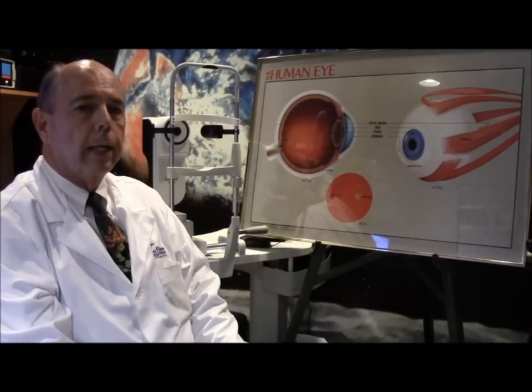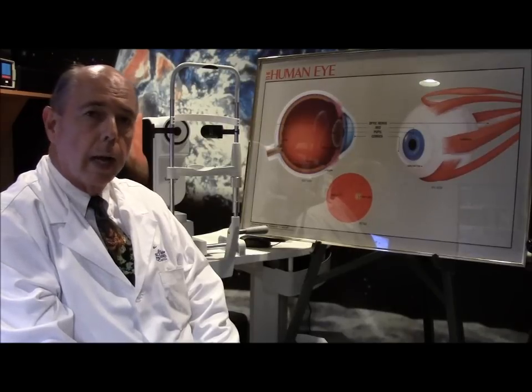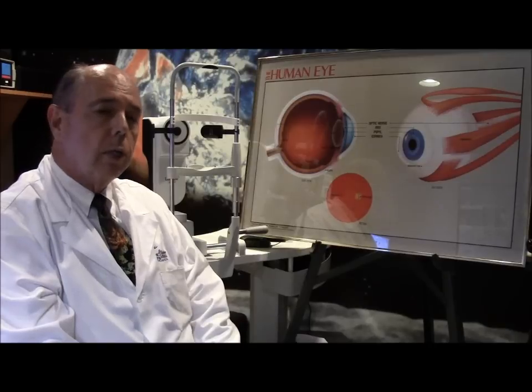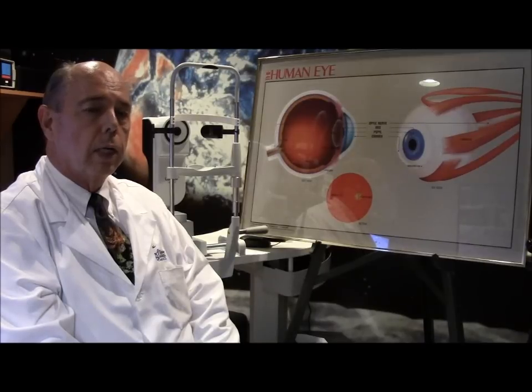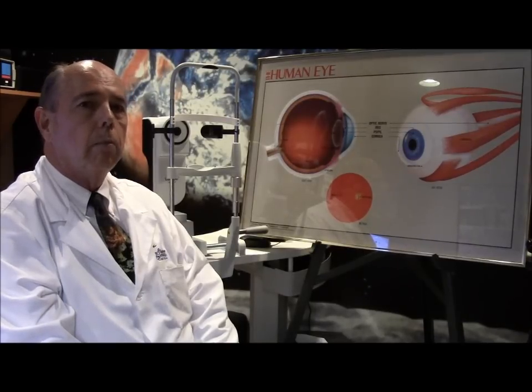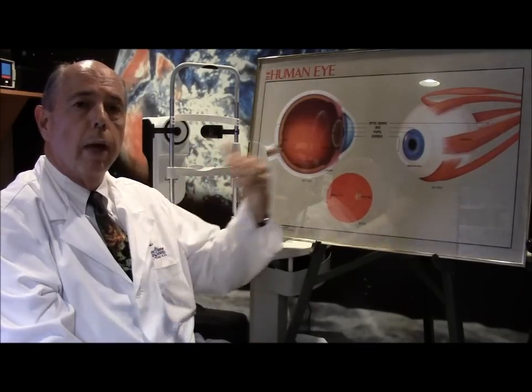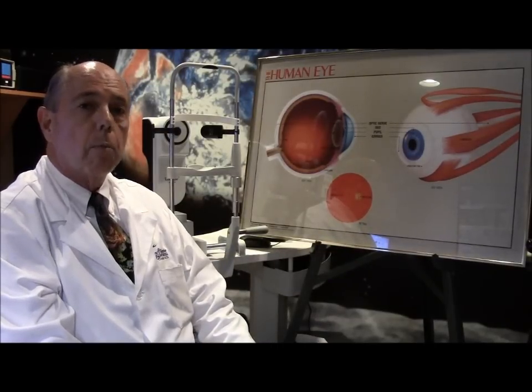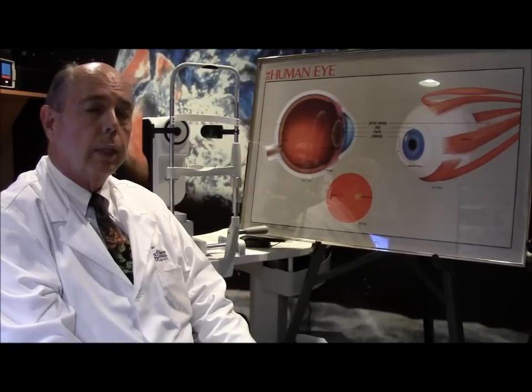That is extremely important if you want a great result from your cataract surgery. There are also other tests we do to help decide what's the best implant and how we can give you the best vision. One of those tests uses a machine called a Tracy Technology machine, which measures different parts of your vision. It performs a wavefront analysis that determines what type of aberrations you have in your vision system — because even if you have no glasses prescription and are 20/20, you still have aberrations in your vision system.